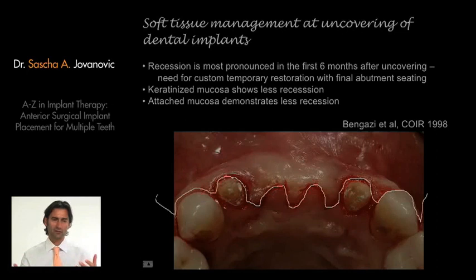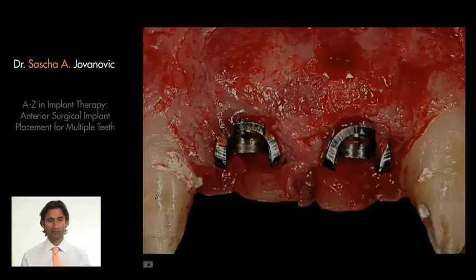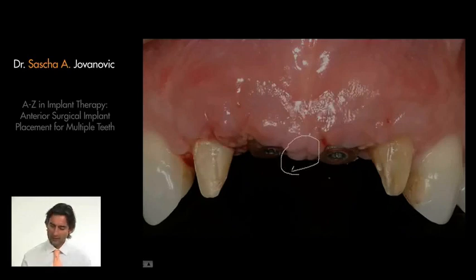And in this way we can have a good flap, we can see what's happening underneath, and we can fill up all the spaces, and we can jumpstart it. Now, I've raised the flap, I'm showing 2 implants, I'm showing good space between the implants, I'm demonstrating that there's good tissue fill between the tooth and the implant and between the 2 implants. And when I place my soft tissue flap back, you can see how it has a tendency to really fill this up. And that's really the concept in these patients, that we have an opportunity to fill up the site with soft tissue.